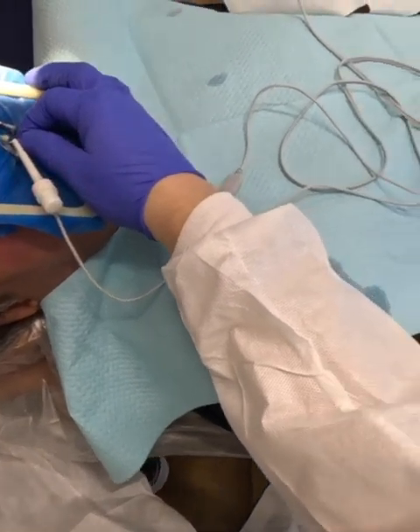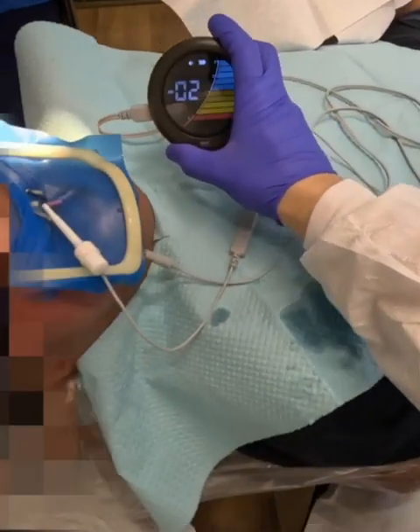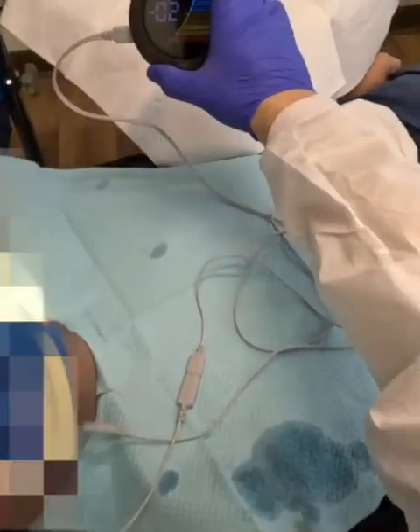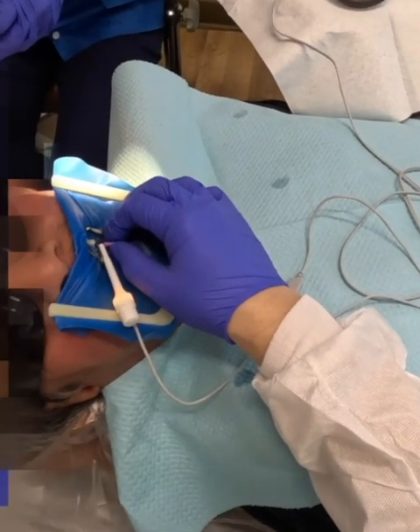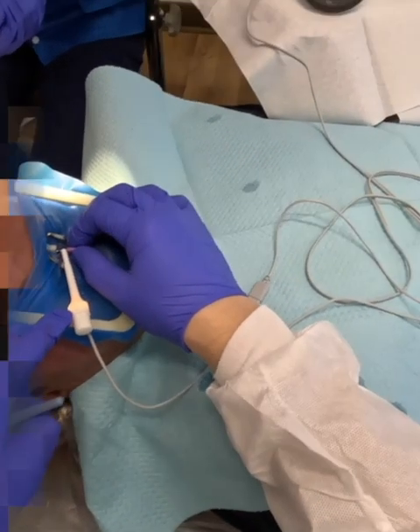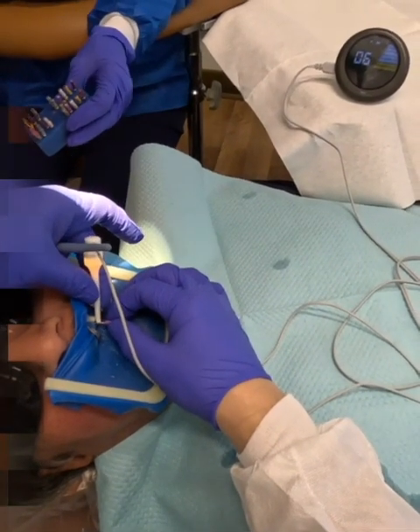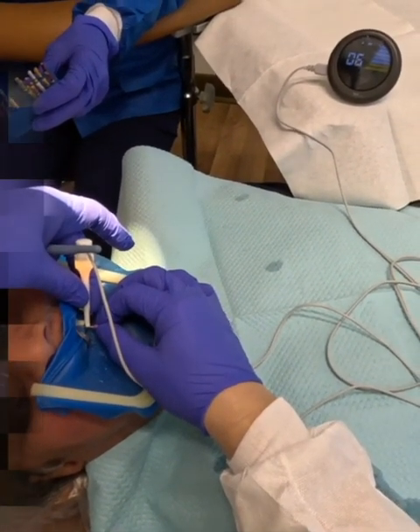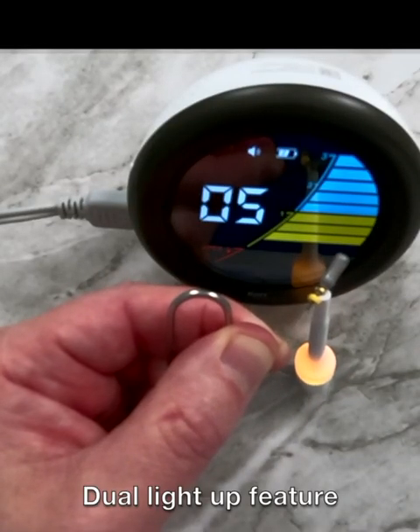It's yellow. Now look how it blinks red — that means I'm out at the Apex. I think this is a really cool feature when using this clinically because I don't have to look back at where the unit is. And then I can back it out, hit the yellow range, and know that I'm now backed out right to 0.5, which is my preference. Knowing that I'm in the yellow, I can really zero in on where I am. So this dual light-up feature is really, really cool.